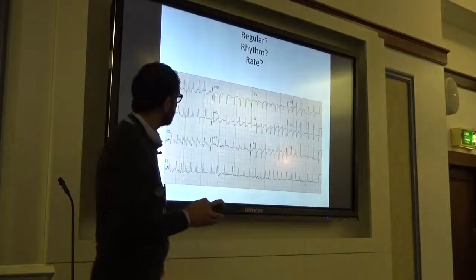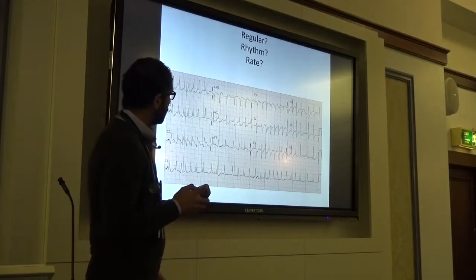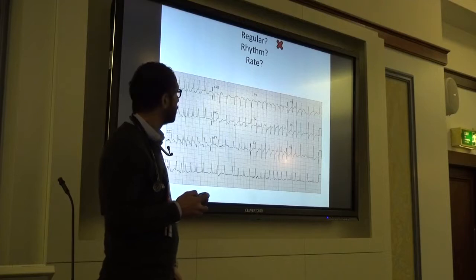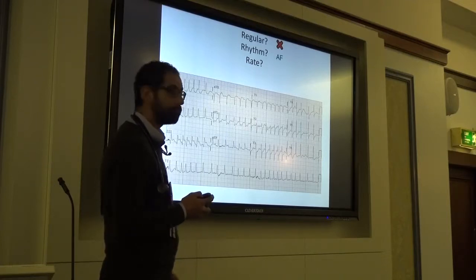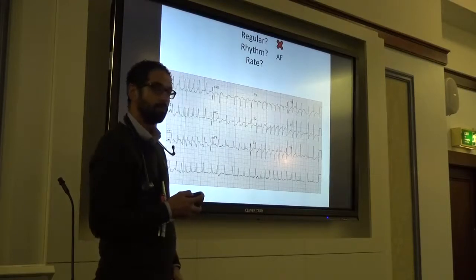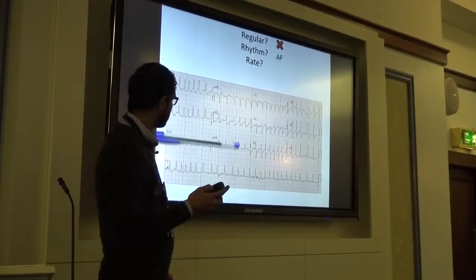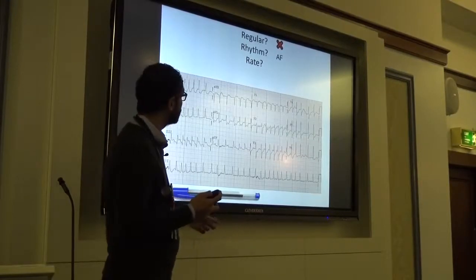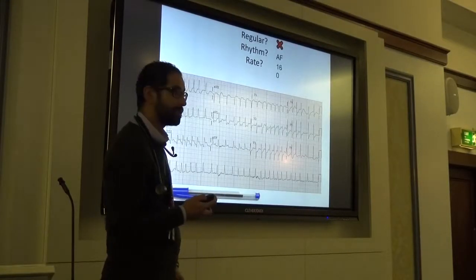Good. So, is this regular? You said no, it's not. What's the rhythm? And what's the rate? Drop the pen. Then we can count, and it's going to be around 160 beats a minute.